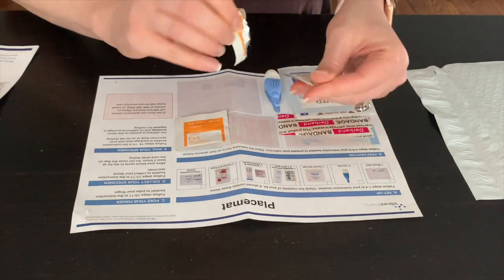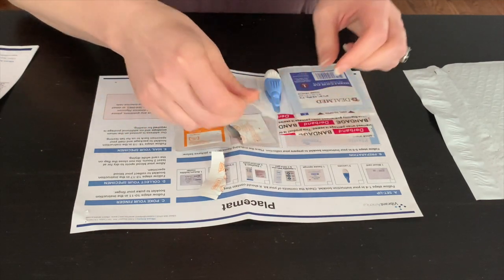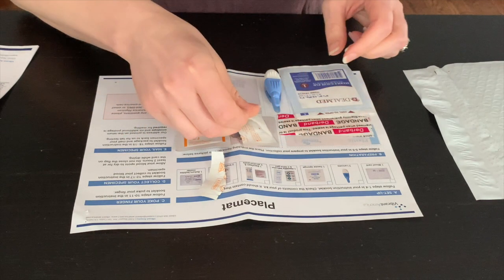Open the alcohol wipe that is provided in your collection kit and place it on the clean collection surface while you wash your hands.